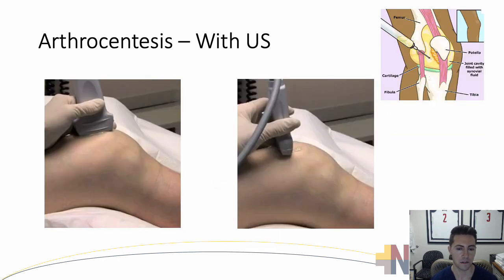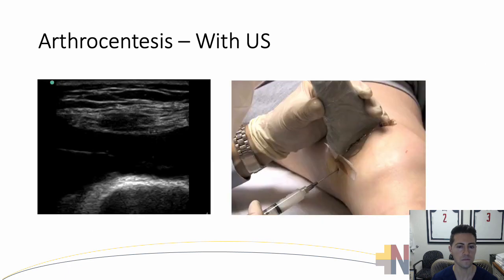In terms of using ultrasound, this is going to be the suprapatellar approach, done laterally. You'll look at the knee first in longitudinal view relative to the quadriceps tendon, and then turn to short axis for your approach. This ultrasound image shows aspiration of a knee effusion — the dark fluid is the effusion being aspirated, and you can see the needle entering that area of fluid. The quadriceps tendon above is hyperechoic, and below is the hypoechoic fluid. Below that is the femur with some pre-femoral fat. The effusion is typically in this area that you're going to aspirate.